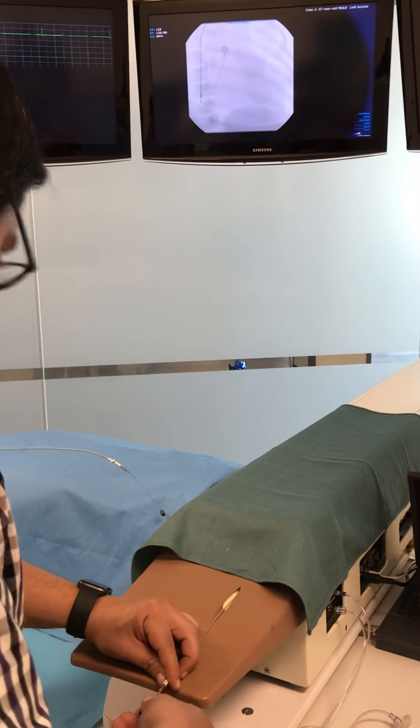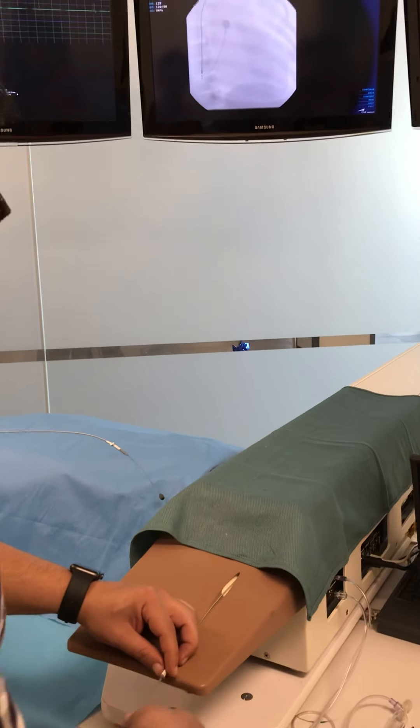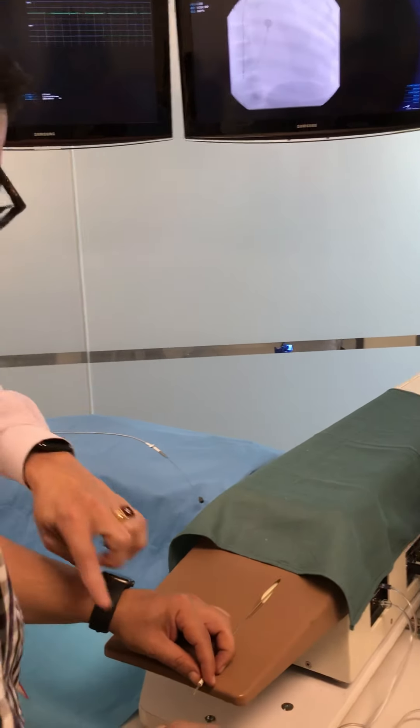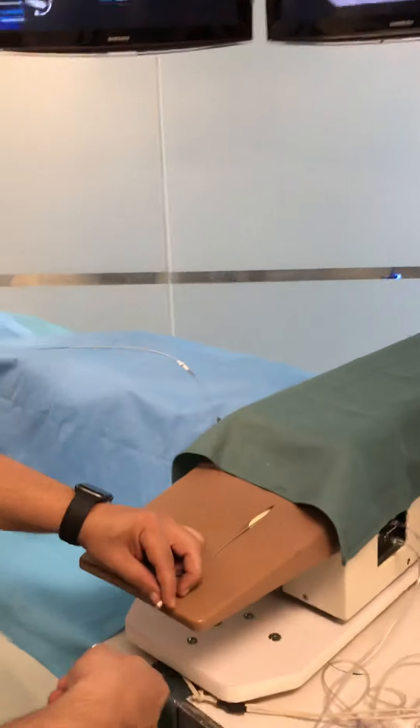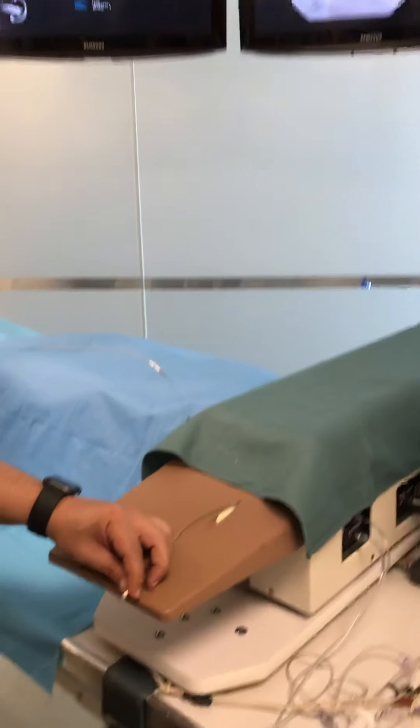You've introduced your lead and now you're ready to swap out for a shaped stylet. For the simulator, just draw that back until you reach the mechanical stop.